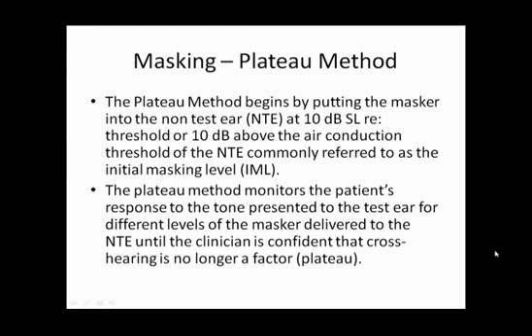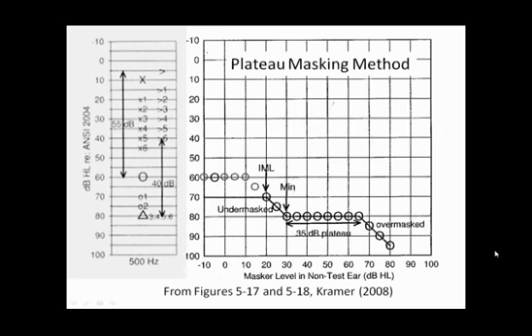The plateau method monitors the patient's response to the tone presented to the test ear for different levels of the masker delivered to the non-test ear until the clinician is confident that cross-hearing is no longer a factor. And that's when we reach something called the plateau.